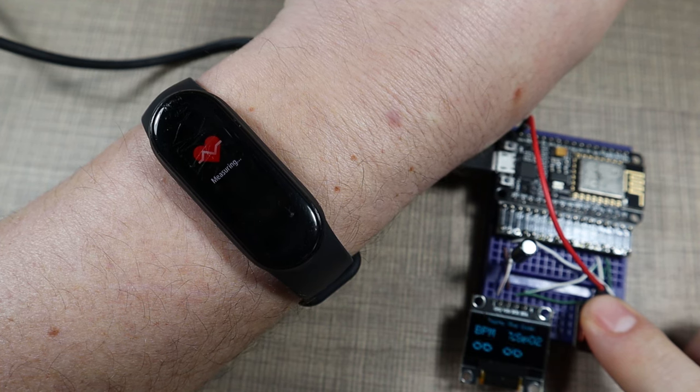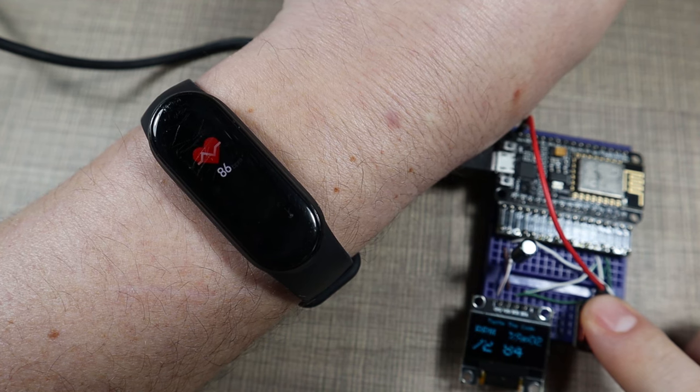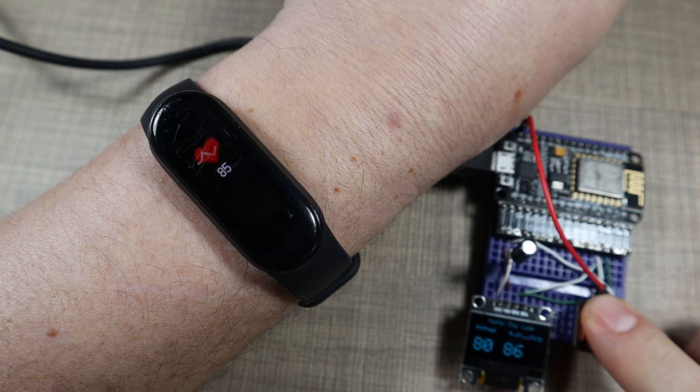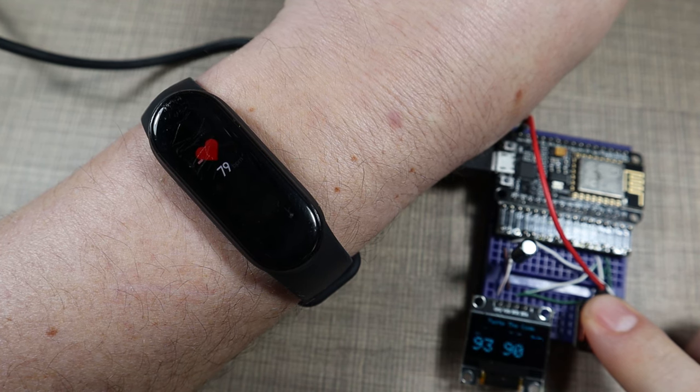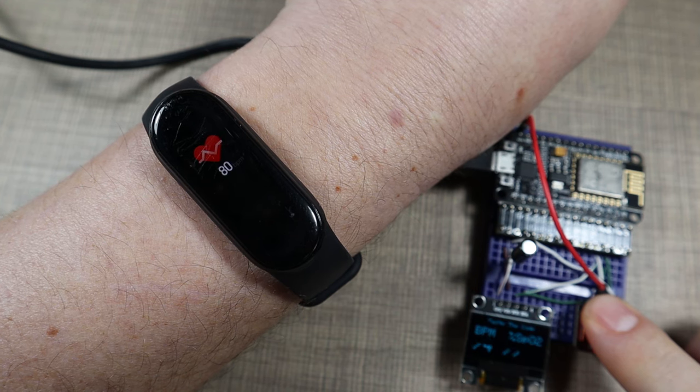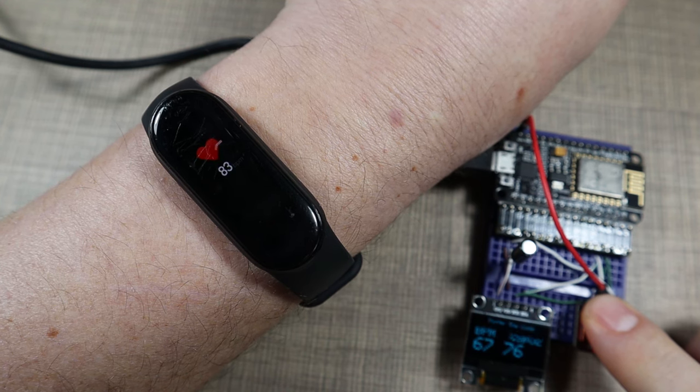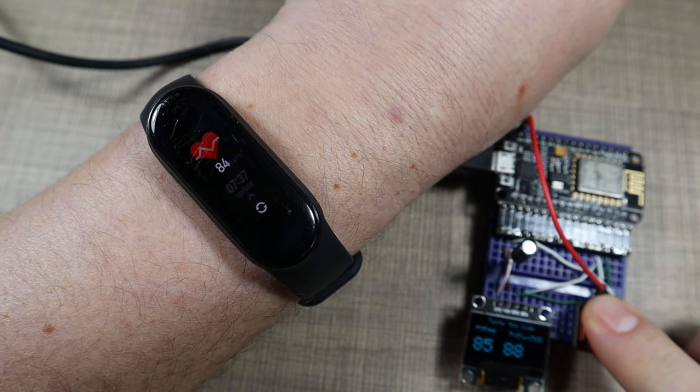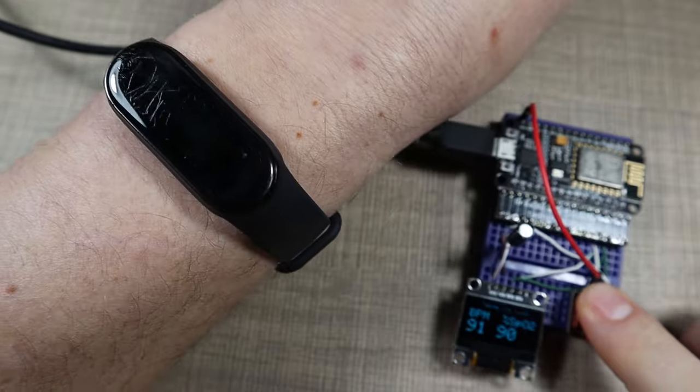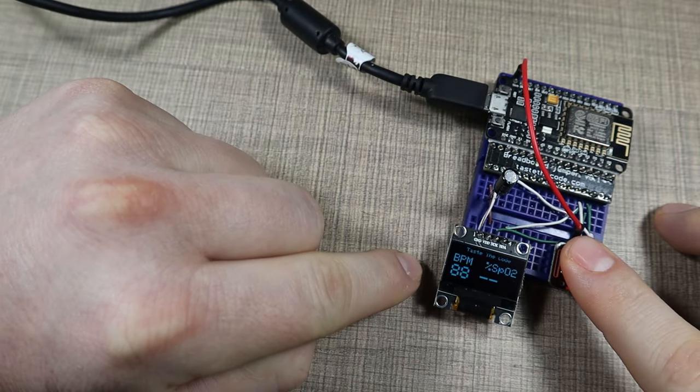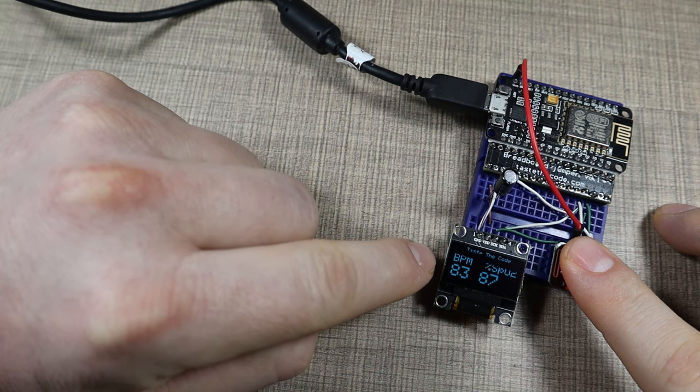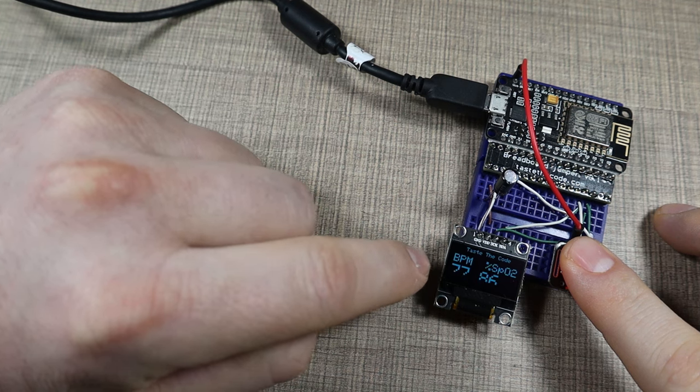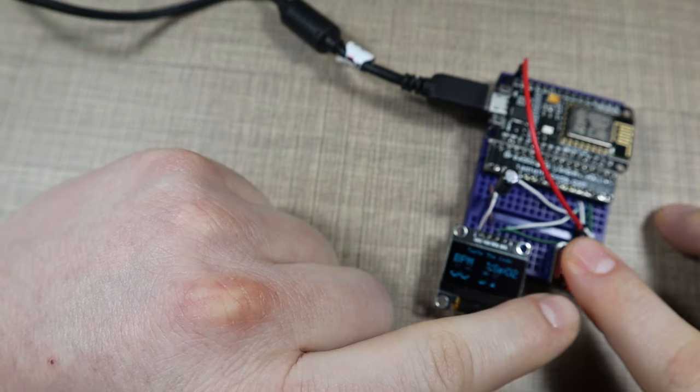So ours measures around 85 beats per minute now, 70 something, and same is around on the Mi band. That settles at around 84, so the version that we did is around 80 to 85, 84. It's more or less counting the same.